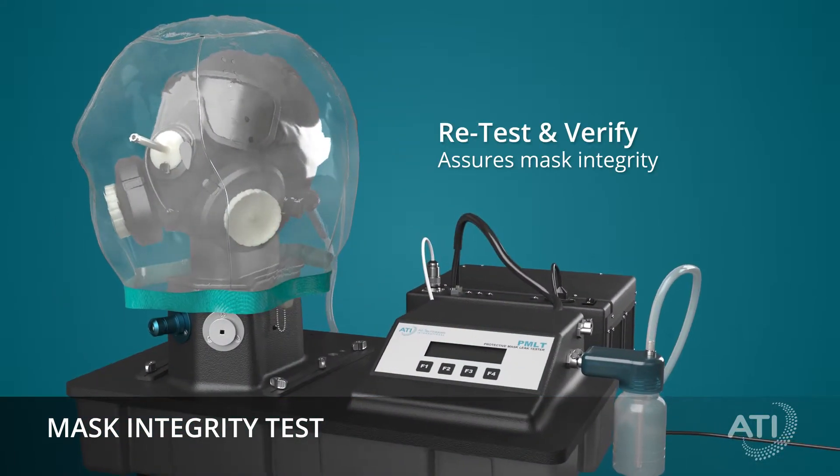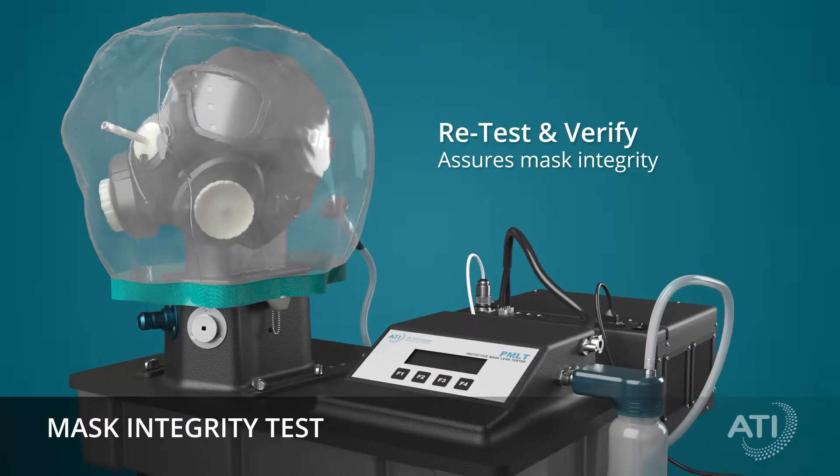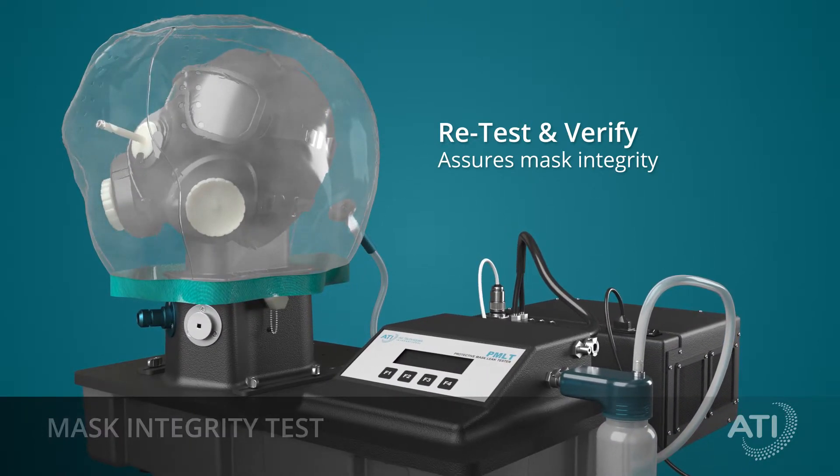After component replacement, the mask is ready for retest to verify the integrity of the entire mask.